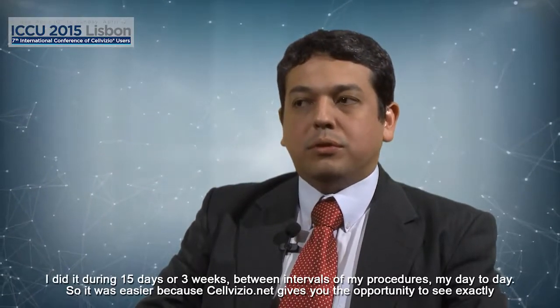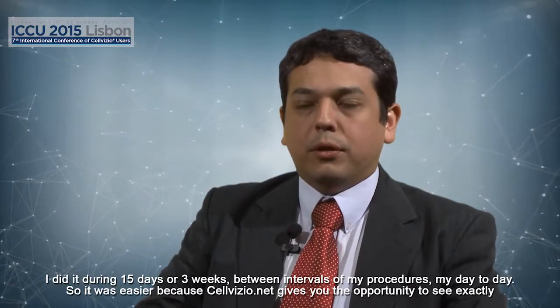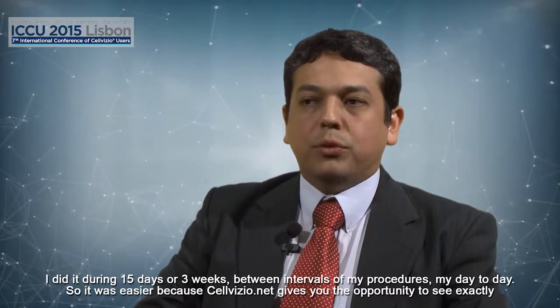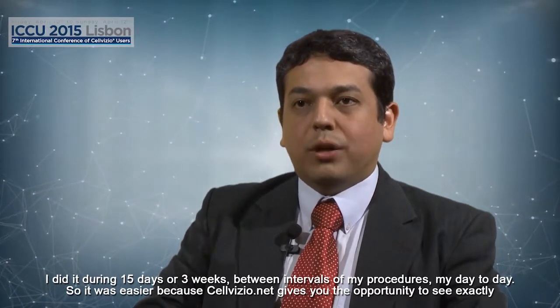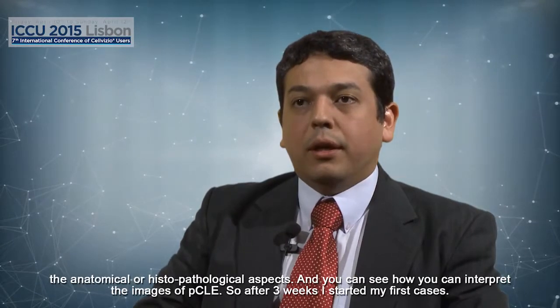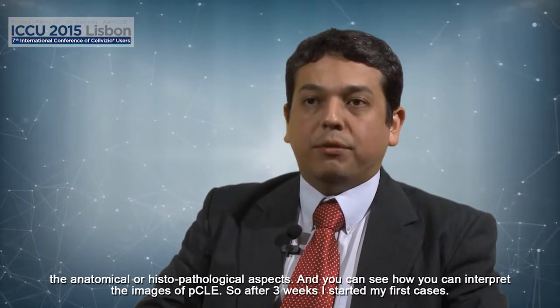So it was easier because Cellvizio.net gives you the opportunity to see exactly the anatomical aspect or histopathological aspect that you see, and how you can interpret this image of PCLE.